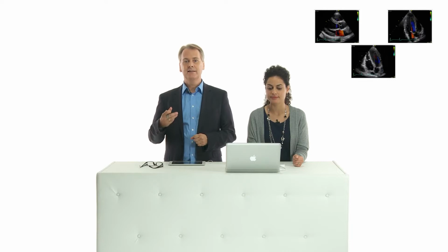Why are we showing you these examples? Because at least at the beginning of my career, I found it very difficult to detect aortic regurgitation because it happens during diastole, and diastole sometimes, especially if patients have a high heart rate, is rather short, and you have to have a quick eye to detect it. So not always is it easy to detect aortic regurgitation, and here is some advice.